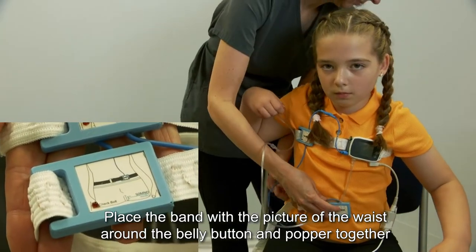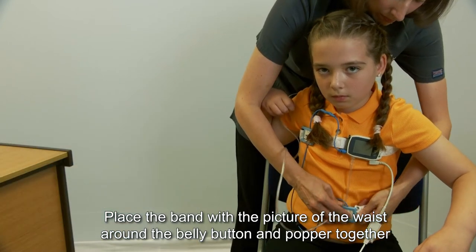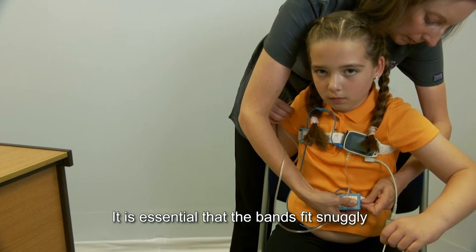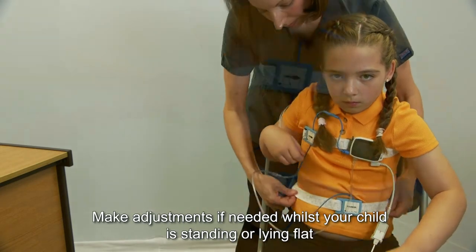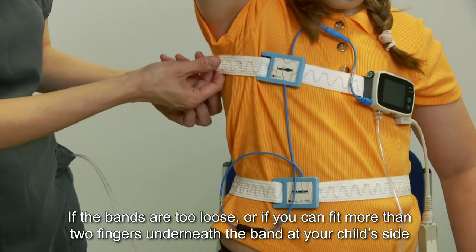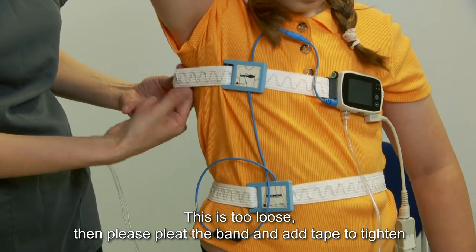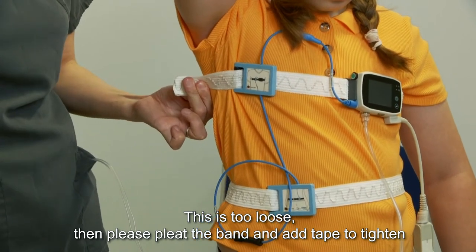Place the band with the picture of the waist around the belly button and pop it together. It is essential that the bands fit snugly. Make adjustments if needed whilst your child is standing or lying flat. If the bands are too loose, or if you can fit more than two fingers underneath the band at your child's side, this is too loose. Please pleat the band and add tape to tighten.